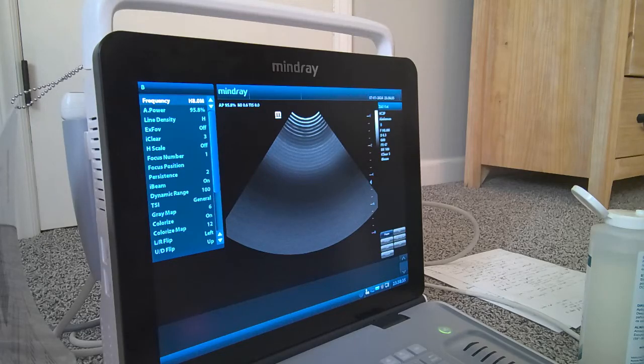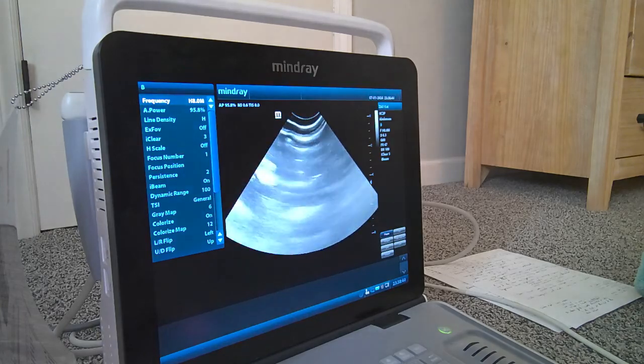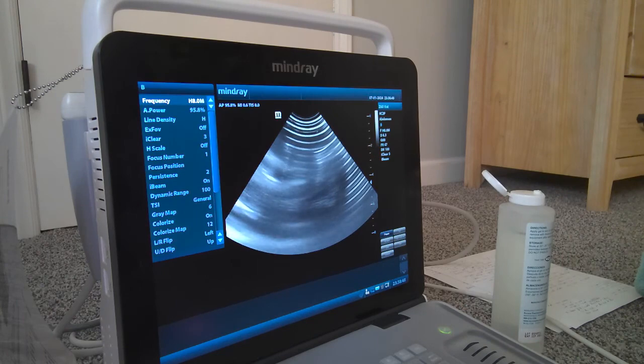All right, so the next thing I would like to look at is going to be the spleen. So I've got him flip back over into right lateral recumbency. So we're looking at the left side of his abdomen. You remember the spleen is going to live in the left cranial aspect of the abdomen.